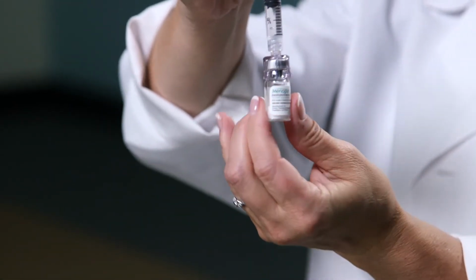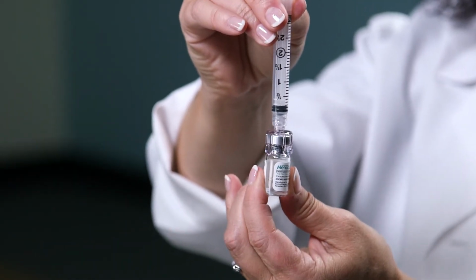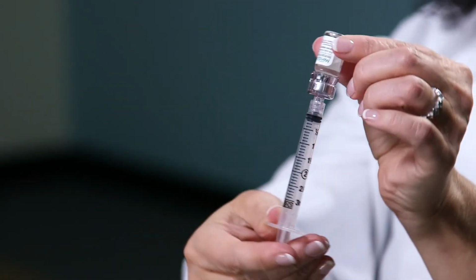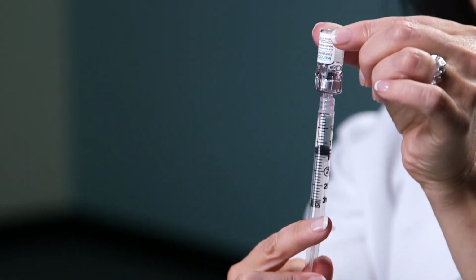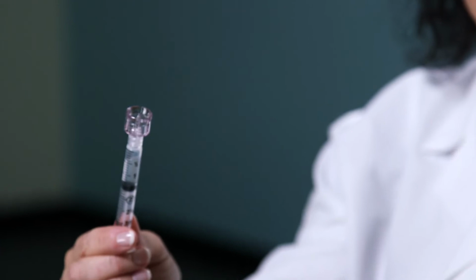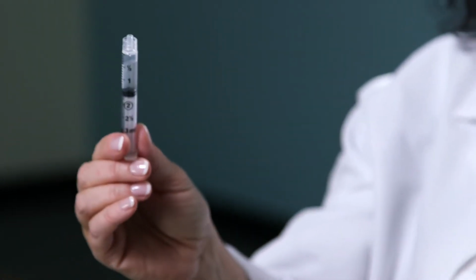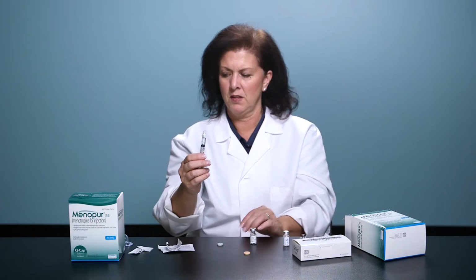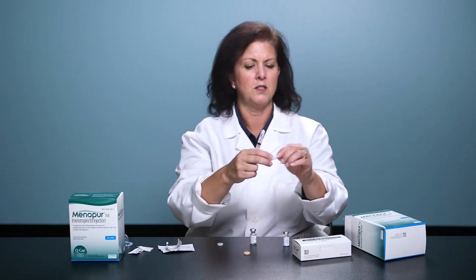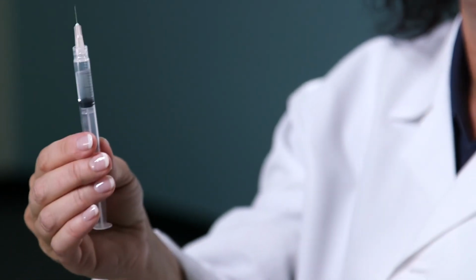And take that mixed solution that you've just created and inject into the second vial of Menopur. Now you have 2 vials of Menopur mixed in the same amount of sodium chloride. Unscrew the Q-cap and discard in a sharps container. You're then ready to attach your 1/2-inch needle for subcutaneous injection.